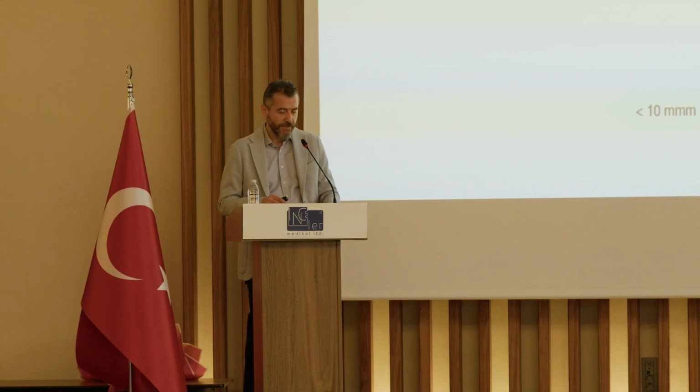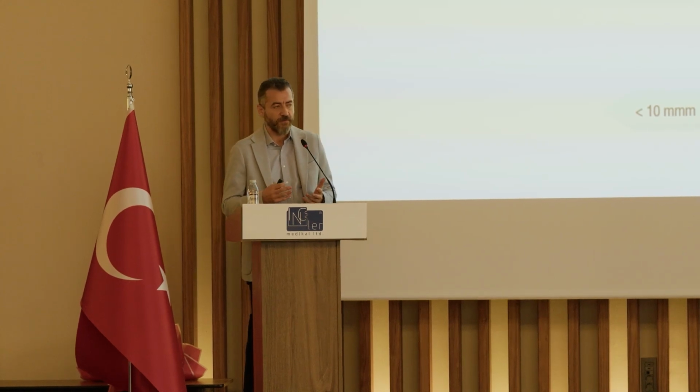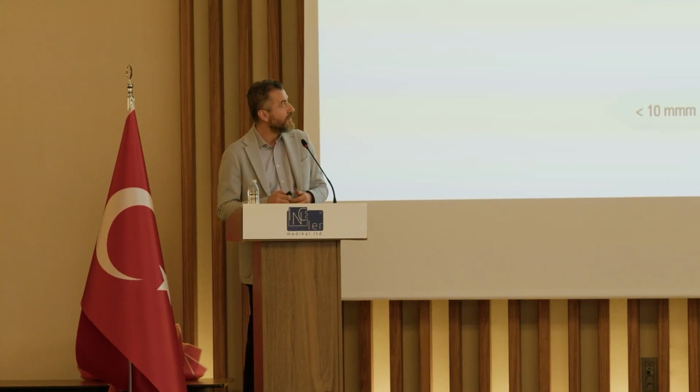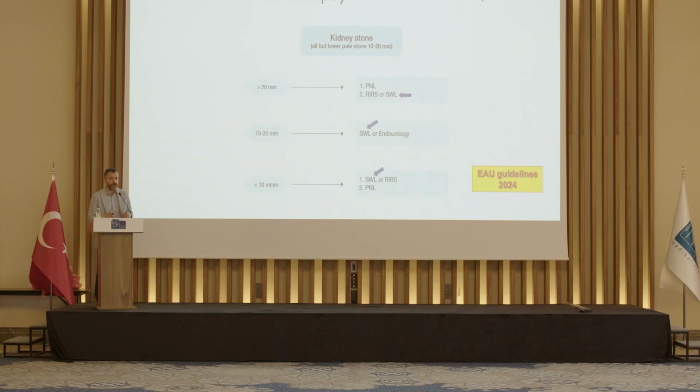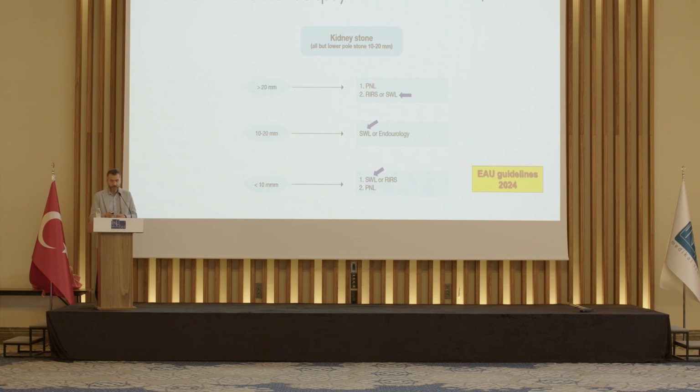So this is our EAU guidelines. This has not changed now almost 10 years, and we have the treatment options of PCNL, flexible ureteroscopy, and shockwave lithotripsy. And for stones that are actually less than 2 centimeters in diameter, shockwave lithotripsy has still a good place. It's still the primary treatment option. And also for stones bigger than 2 centimeters, it can be considered as a secondary procedure.